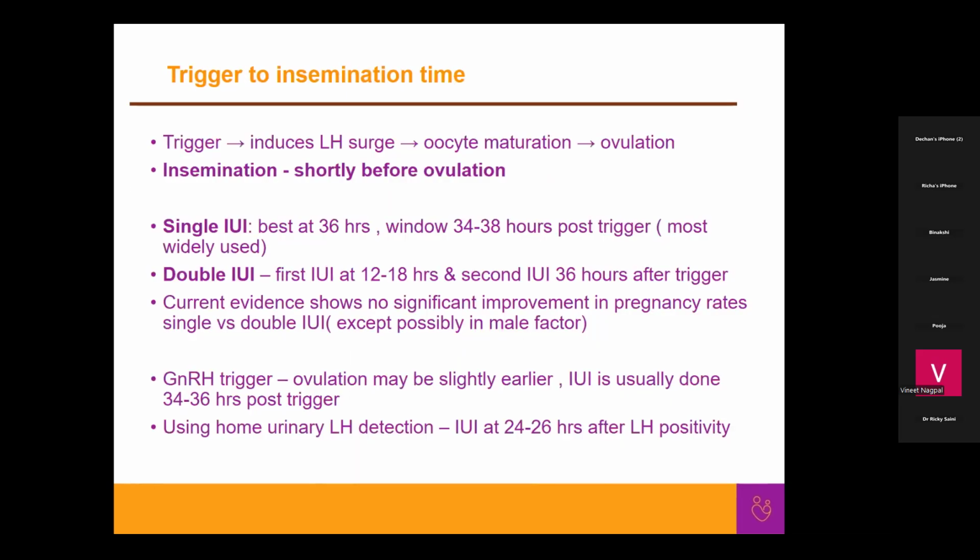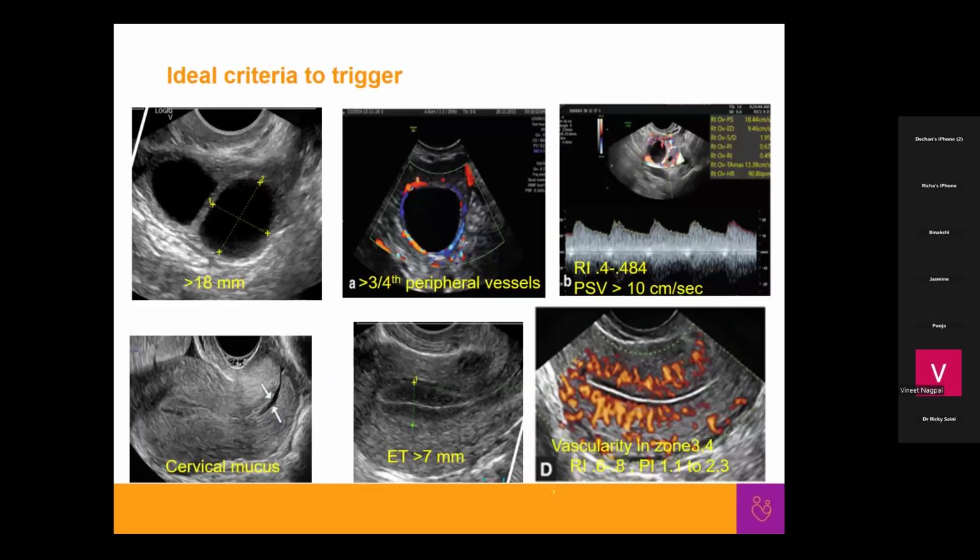But then comes, just go back. The more important part is the coordinated development of the follicle and endometrium. If we leave the color Doppler aside, if the follicle has matured and the endometrium has not picked up, then the follicle will not rupture.